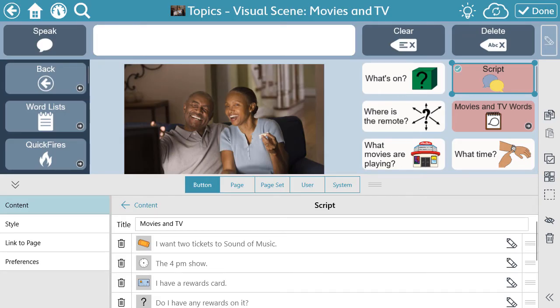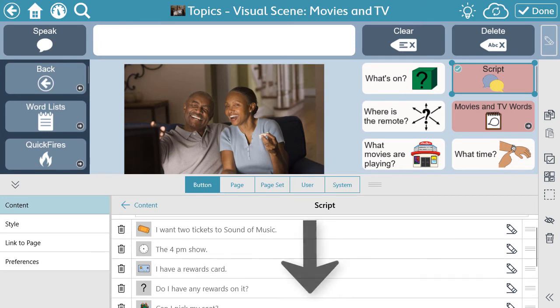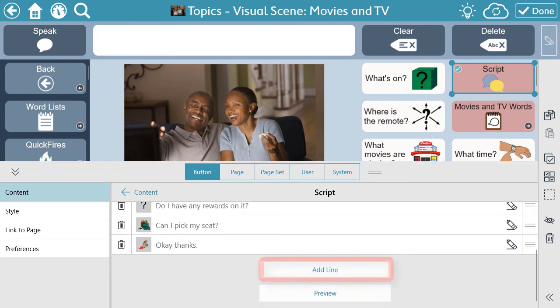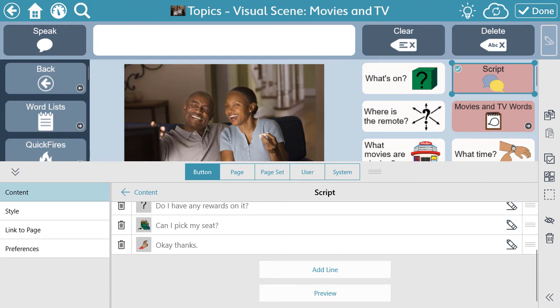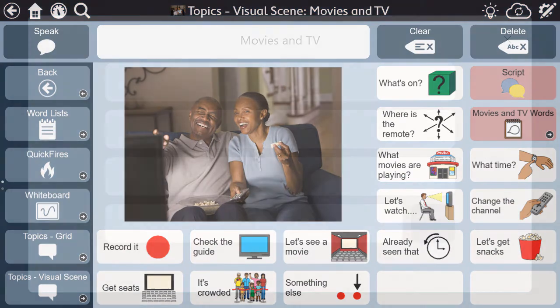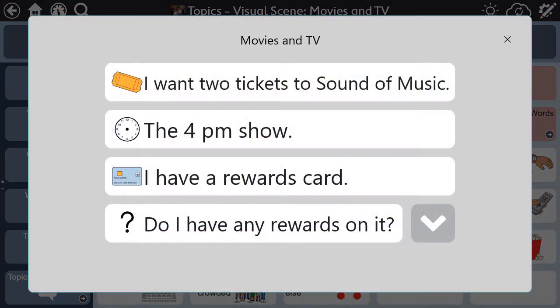You can also add a line to the script by scrolling down to select Add a line. Select Done when your script is ready. Now you have a personalized script ready to go.